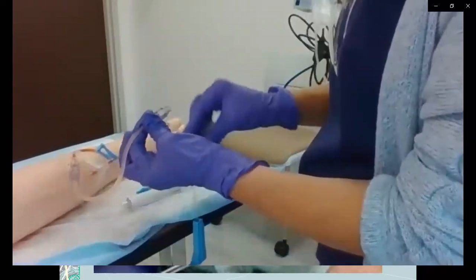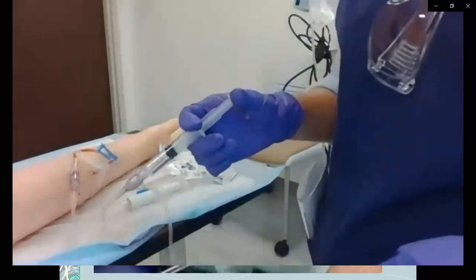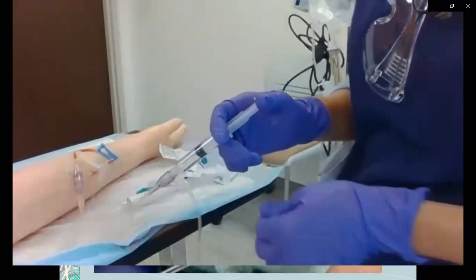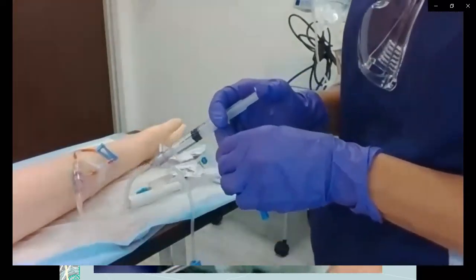Got our medication. So we're going to connect. Administer over whatever is prescribed. I suggest you look at a clock because if there is something that you are given over 2 or 3 minutes, 2 or 3 minutes is a lot longer than what you think.